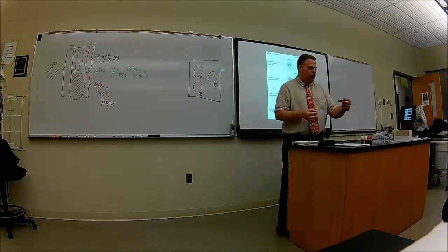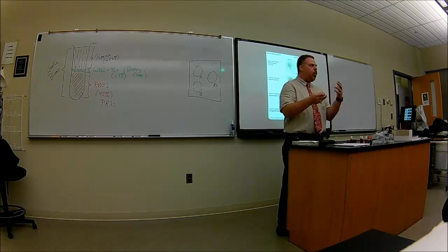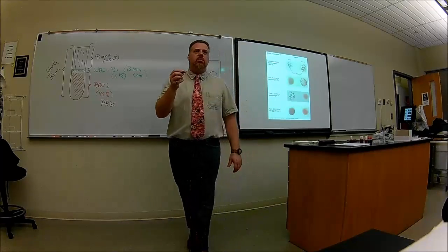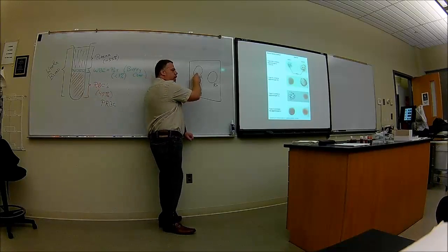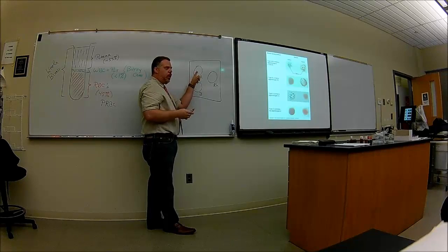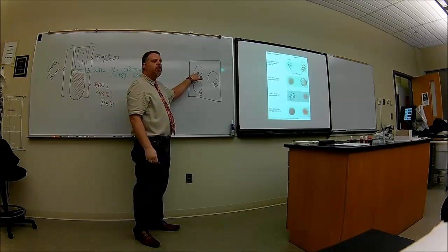It'll say Mr. Brown, or sample A, sample B, or sample 1, sample 2. So you don't know what blood type this is, just like you don't know what your blood type is. So what you're going to do, you have antibodies to A here, 3 drops in here, and we're going to put 1 drop of unknown blood in here.